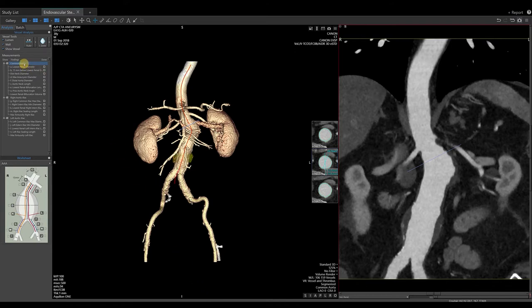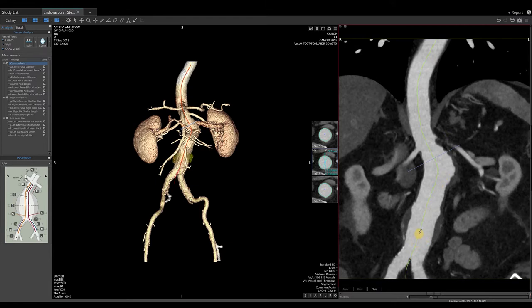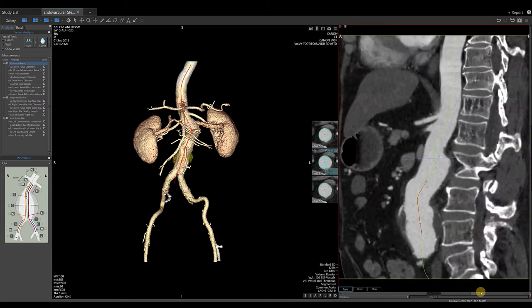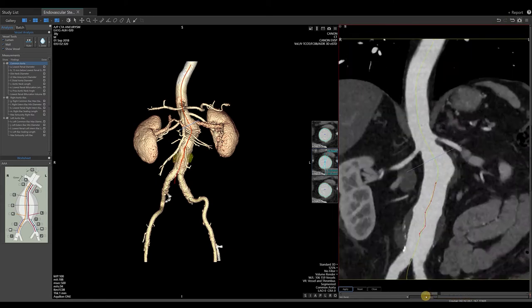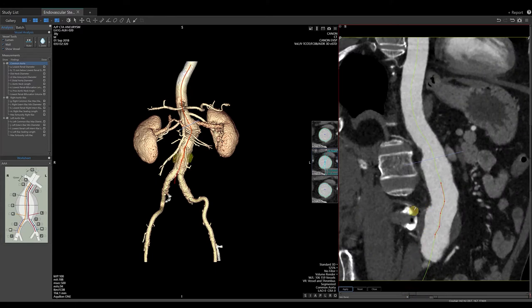Prior to creating any measurements, ensure that the common aorta is highlighted blue on your worksheet. In our curved planar reformat or CPR, do a right-click to bring up the right-click menu and select the top option, Set Center Line. This will draw a green line down what it believes is the center of the vessel. To make changes to this line, plot points within the vessel and grab any points and move them as needed. Rotate around your vessel to verify that you've placed your points correctly in all views. To save these changes, select the apply button in the lower left corner of the CPR image.